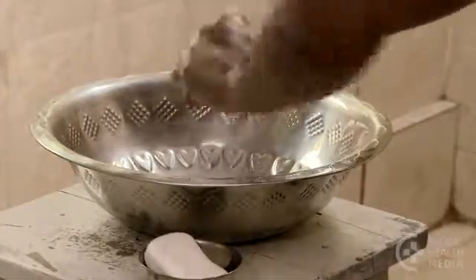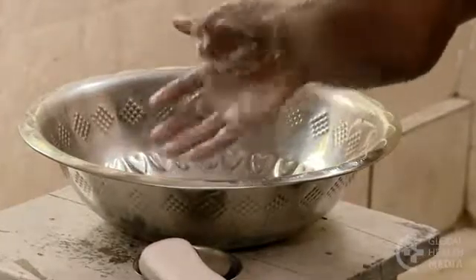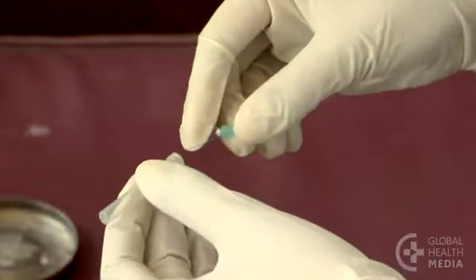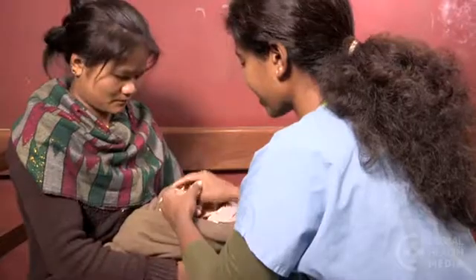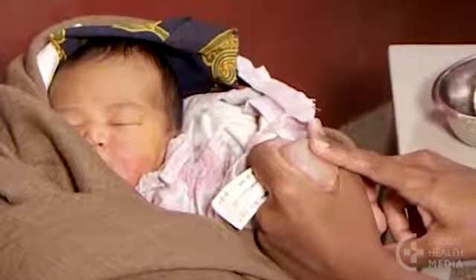Before you start, wash your hands. The easiest way to draw blood on a baby is to use a sterile needle. Start by finding a good vein in the baby's hand. Then put on gloves.